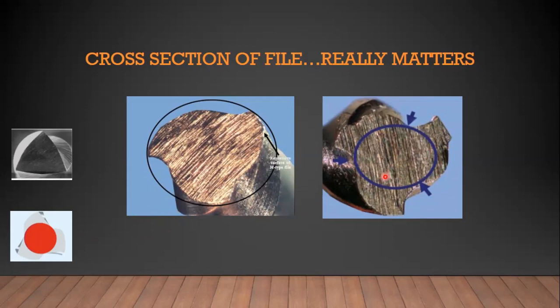It affects the torsional resistance and the flexibility of the file. The bigger the core, the less flexible, but the more torsional resistance. The relative diameter of the core compared to the file's total diameter may vary along the working surface. Why does it vary? In order to change the flexibility and the resistance to torsion.